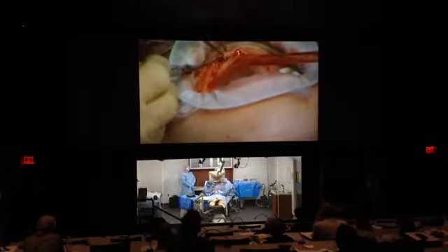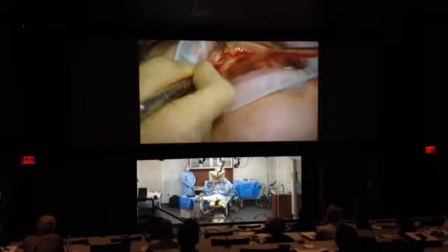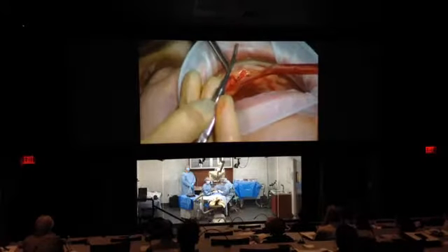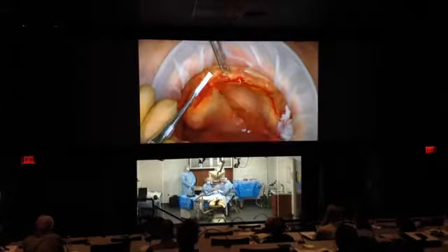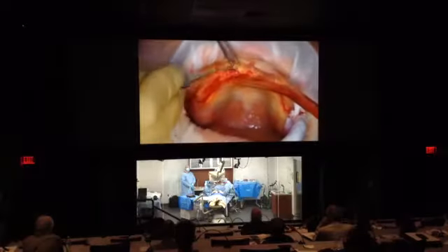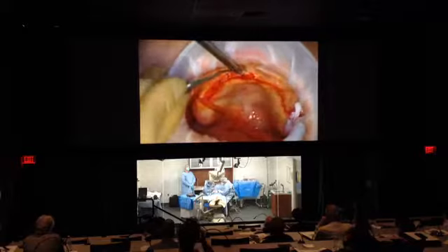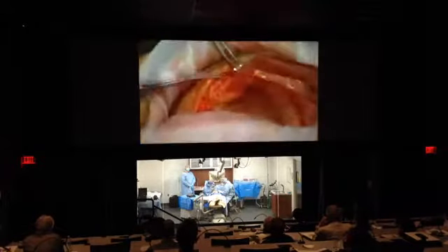This is a chisel. The reason, something smaller that I can have more control, and the edge of this chisel is actually a little bit sharper here. So you see, I can have more control when I'm reflecting flaps. These come in different sizes, so this one's probably 3 millimeters wide, but you can certainly pick one that's a little bit wider. Just depends on your preference.